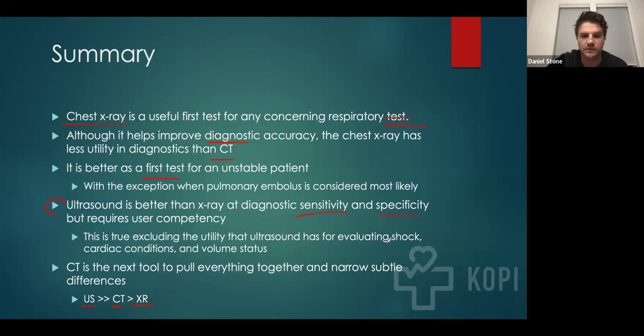We'll talk about this at a later lecture, but it's a helpful tool to have for shock, cardiac conditions, and assessing volume. So when you put everything together with an ultrasound probe, it's just a better tool. And we can talk a little bit more about how that all comes together.